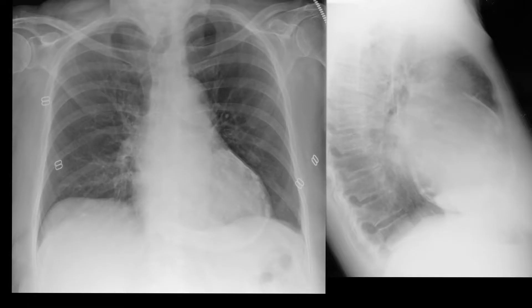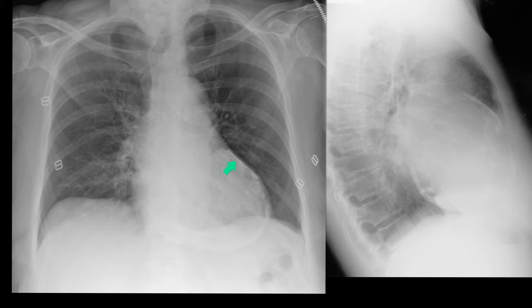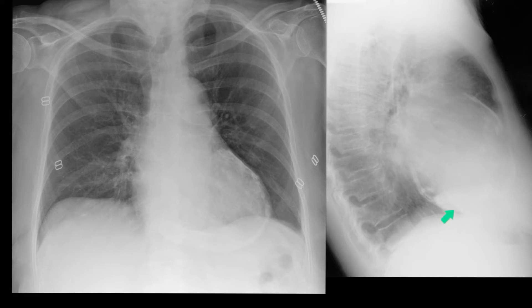This is a PA and lateral chest X-ray in a patient who has pericardial calcification. It is contiguous and is enveloping the left ventricle and going up across the left heart border. On the lateral view, it's both posterior, apical and anterior.